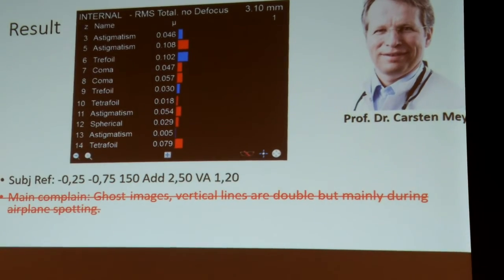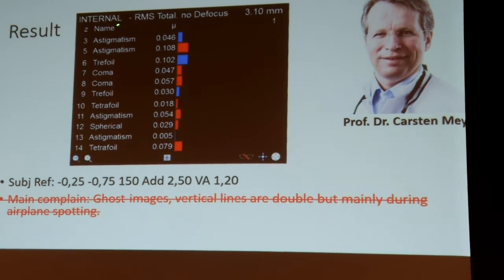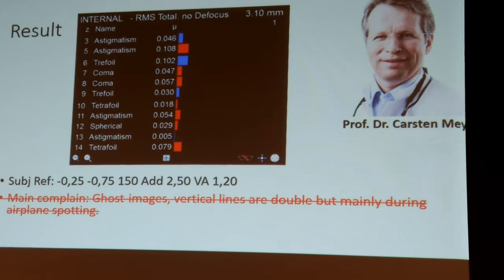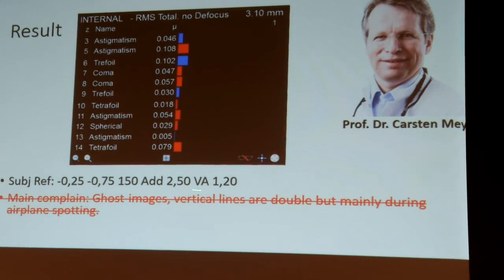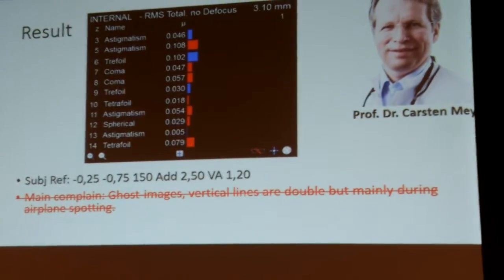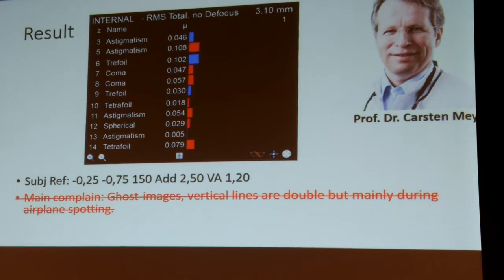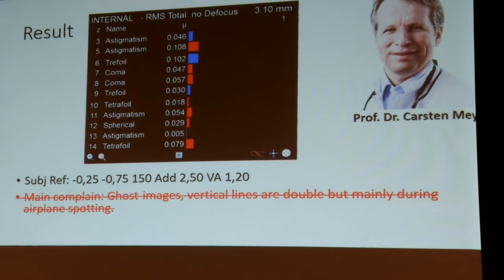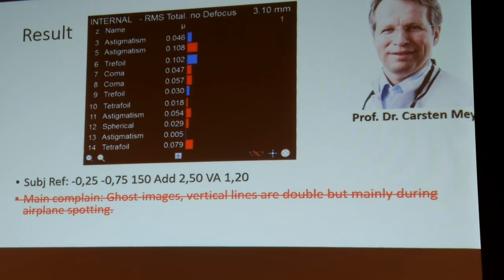At the end he did it, and if you look at the eye trace after the surgery, that's just internal, because we haven't done anything on the cornea, but all the aberrations are mainly gone, down to a normal level. And his main complaint is gone, so he's flying his airplane now. He's really happy. Because we were the number 4 opinion, all the other clinics told him everything is fine, which we did as well at the beginning. We said, oh, 20/20 vision, lens is clear, come on, that's fine, just get used to it. But actually it wasn't. That's why this is a case where the eye trace helped us quite a lot.